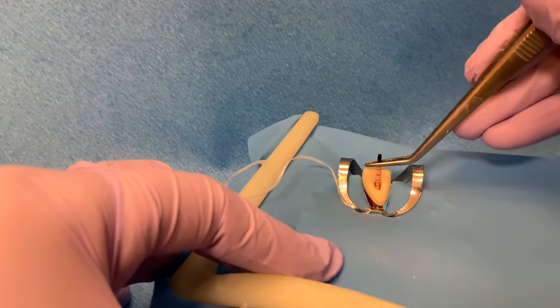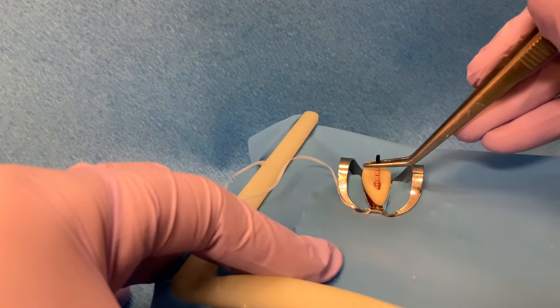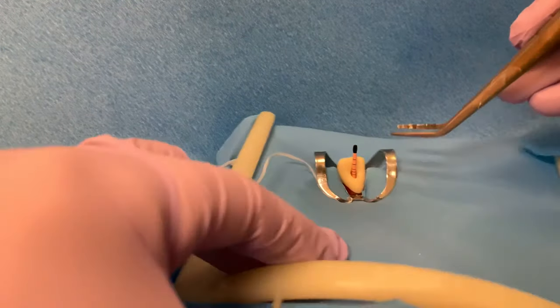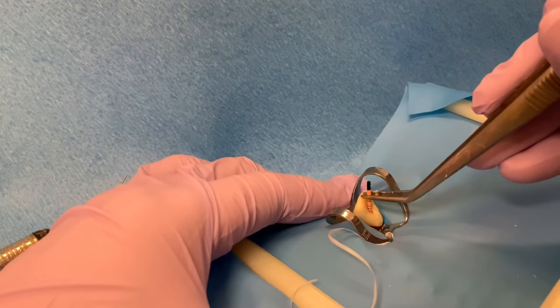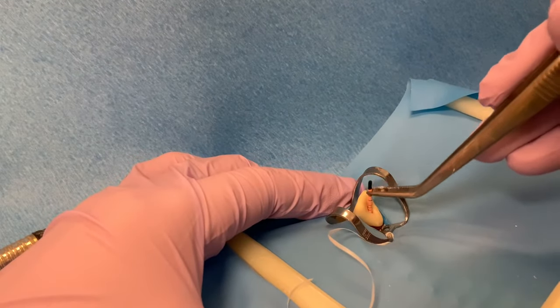Insert the cone into the canal. The bottom edge of the forceps are aligned with our reference point, the incisal edge, the same way the rubber stopper on the file was aligned with the incisal edge during cleaning and shaping. This cone seats to our working length of 25 mm; however, there is no tug back, meaning there is no resistance when pulling the gutta percha out of the canal. It easily comes out.